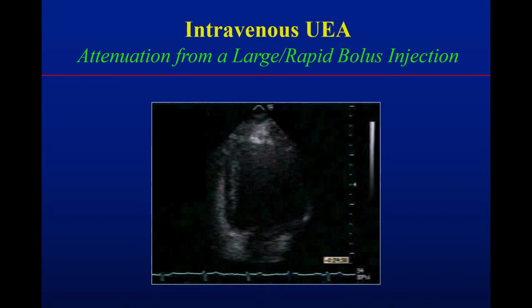So let's talk about technology a little bit, and what do you expect? Now, if we inject contrast, and I'm going to try to show it here, you're going to see some enhancement on the right side of the heart. This is where the right ventricle is.